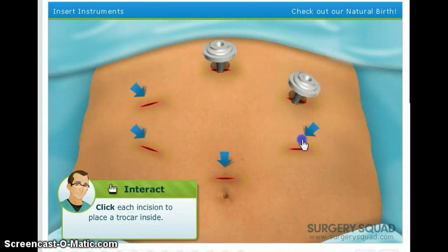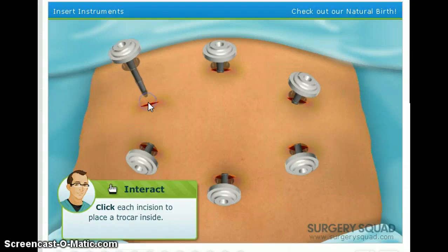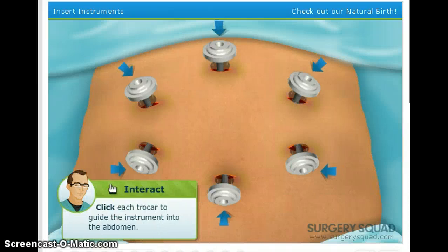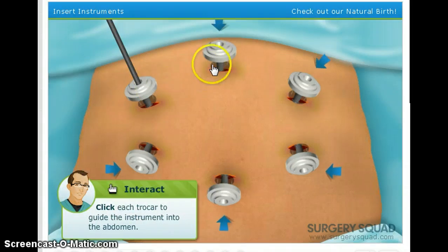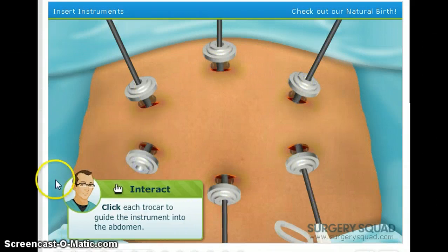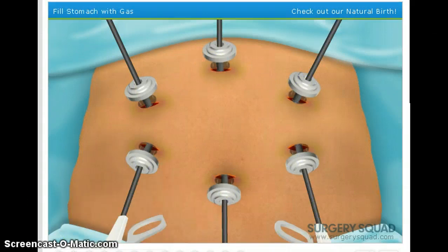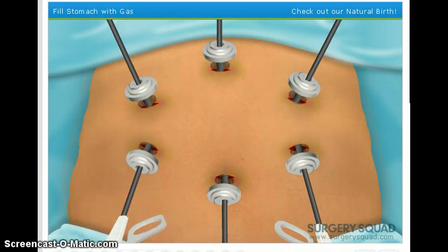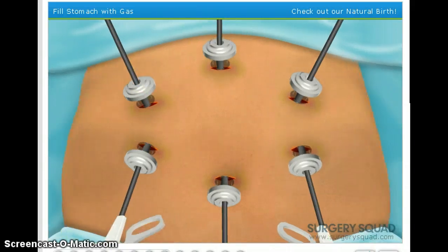Ah. Ew. Squishy. Okay. These devices allow us to easily slide the instruments into the abdomen. Some of the instruments we'll use include a light and a camera, so we can see what we're doing on a video monitor, as well as the surgical instruments. Okay, now, to give us plenty of room to work, we fill the abdomen with carbon dioxide. Let's face it, with a newbie helping out, we'll need all the room we can get.